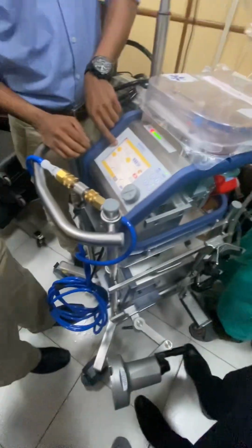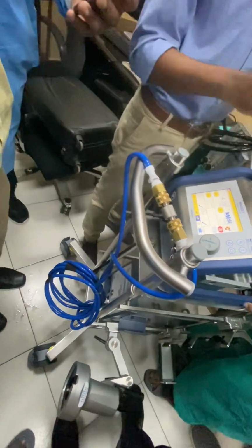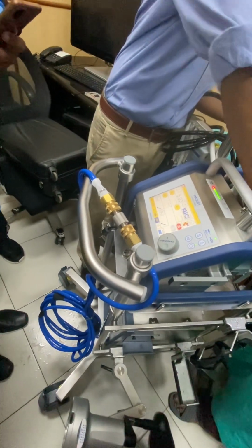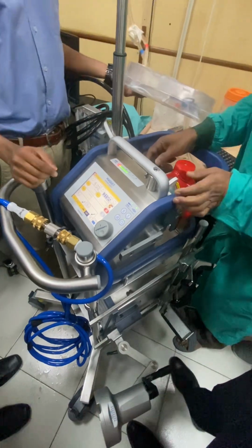Now we are not getting any pressures here. What can be the reason? You haven't attached the pressure sensor. Yeah. We removed it during the action. Can you connect it?